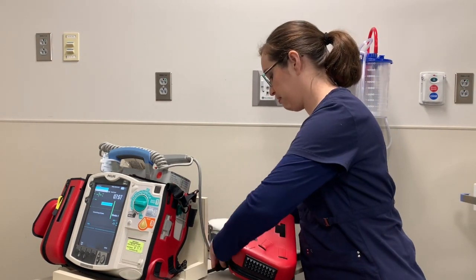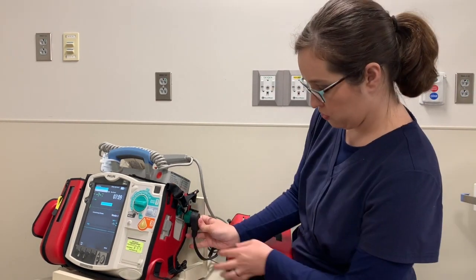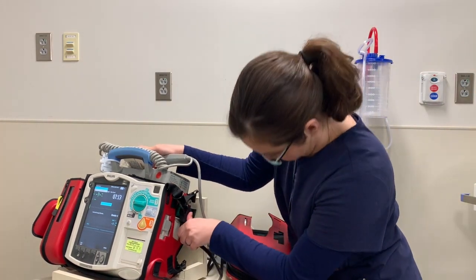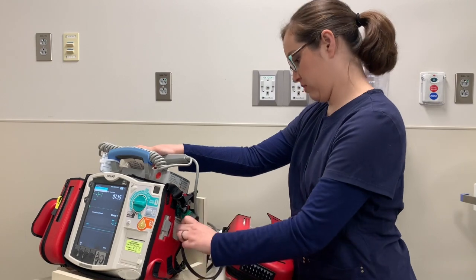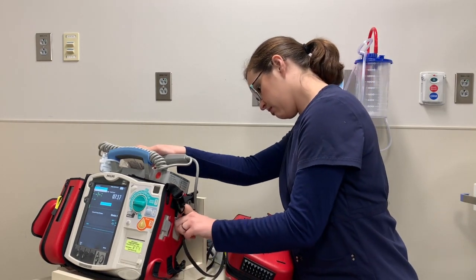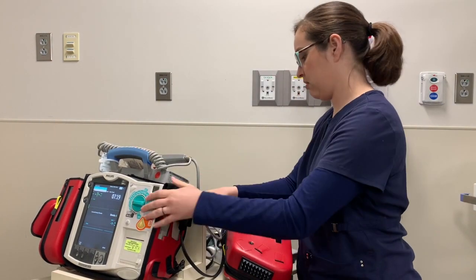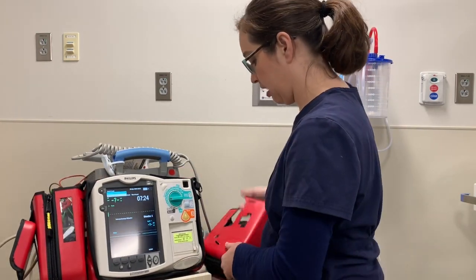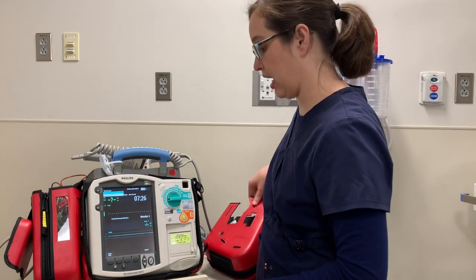For now I want my pads plugged in, as that is what we use most often. Sometimes it's a little tricky to get that on there, especially when the device is mounted. You can take it off using these Velcro tabs.